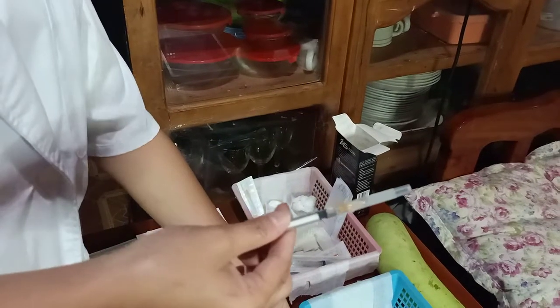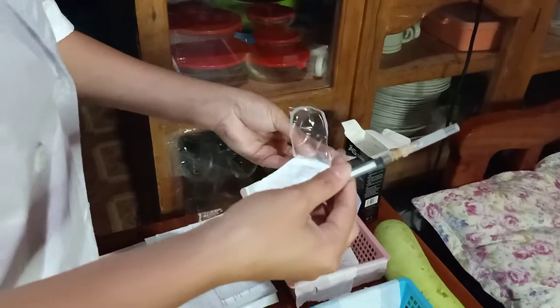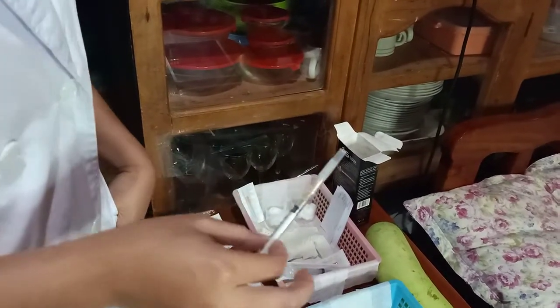Now discard the aspirating needle. Use the waste receptacle. Also, do not forget to write into the medication ticket the name of the drug and the dosage.